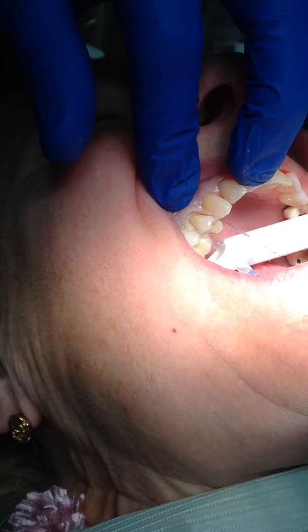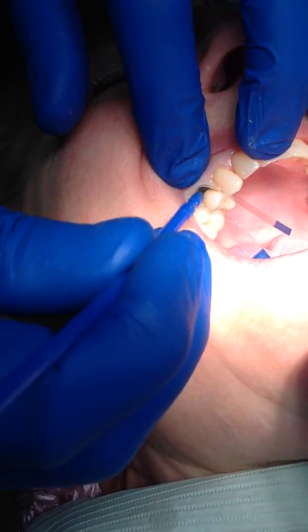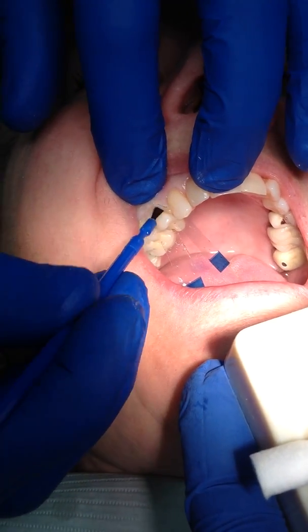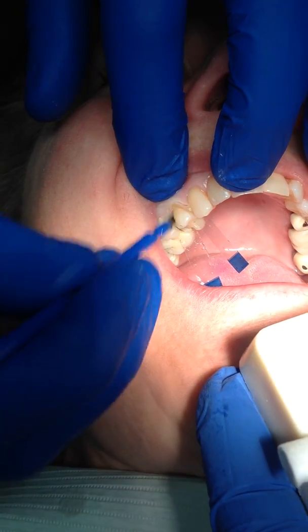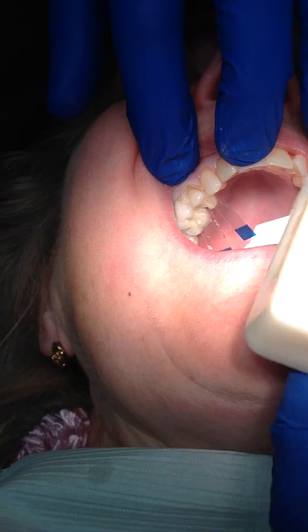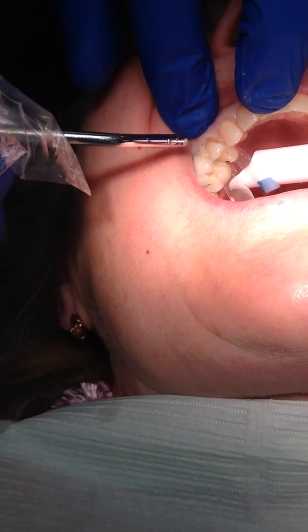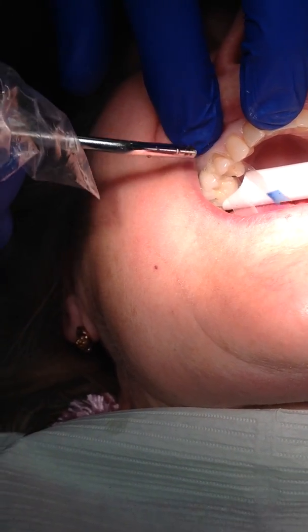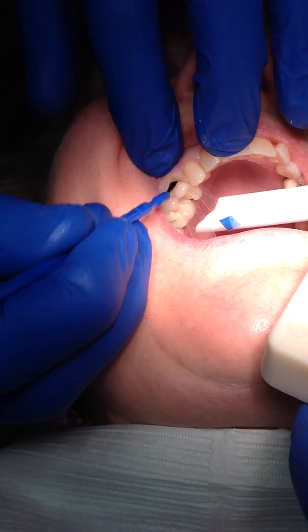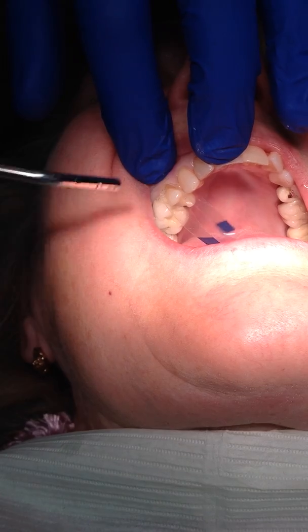Next we'll take — I happen to be using Liner Bond 2; you guys will be using Prelude. But this is the primer. And notice I'm using a brush rather than the Micro Brush, because the brush will get into the area at the gingival aspect of the band much better. The Micro Brush will tend to be a little too fat and will actually break the bonding agent away from the tooth, which means leakage and all the advantages of the band go away. Make sure we evaporate all of the solvent, then go through and add our bonding agent. Blow off the rest, and we're ready to light cure.